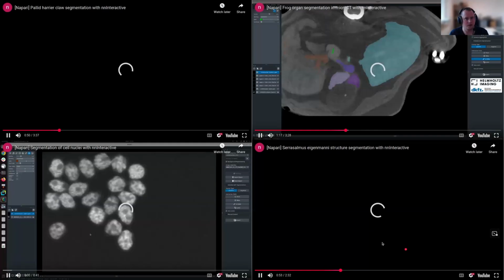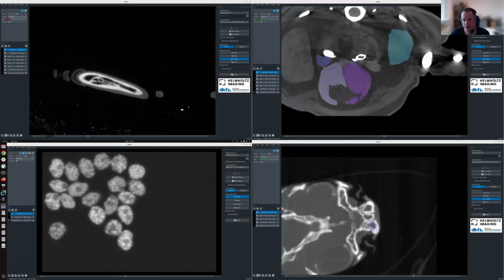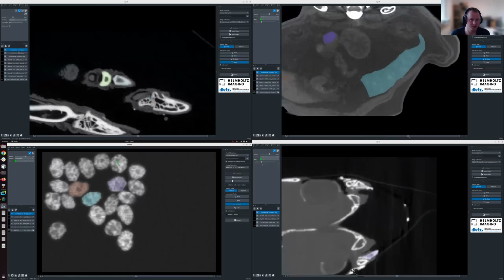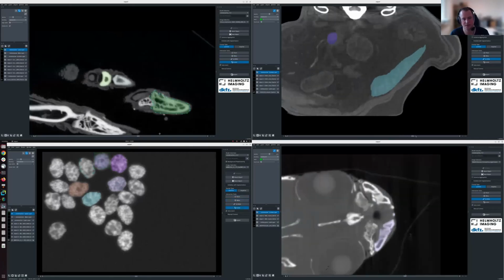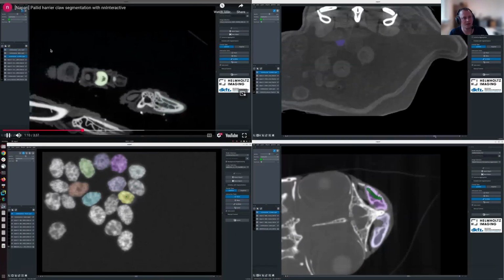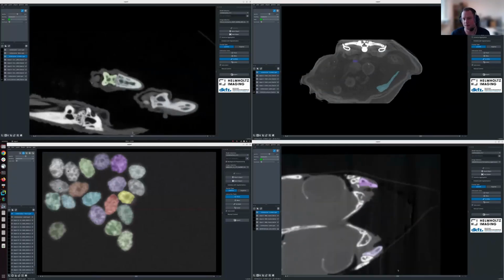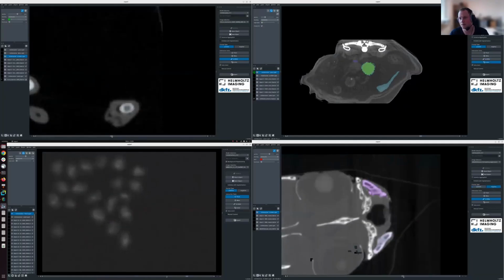With that, I'm already basically at the end of the presentation. I just wanted to show some more wild examples that we worked on for demonstration purposes. These are 4 examples that are not necessarily known to nnInteractive from its training distribution, except maybe the microscopy example. But you see here a bird claw, frog organs, or fish. And in all of these different images, even though we've never seen this species before, we can work with nnInteractive to segment target structures and to get what we want.